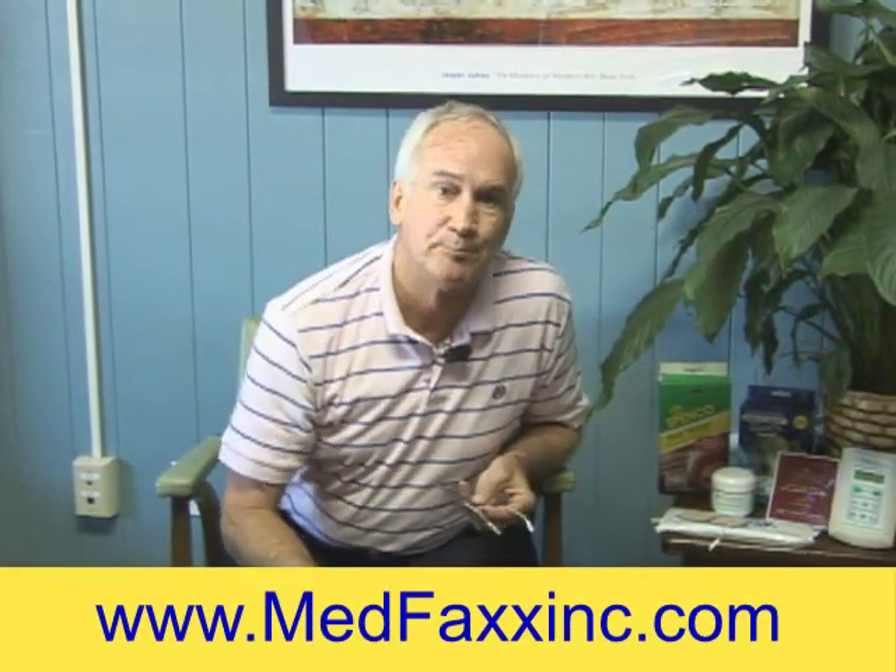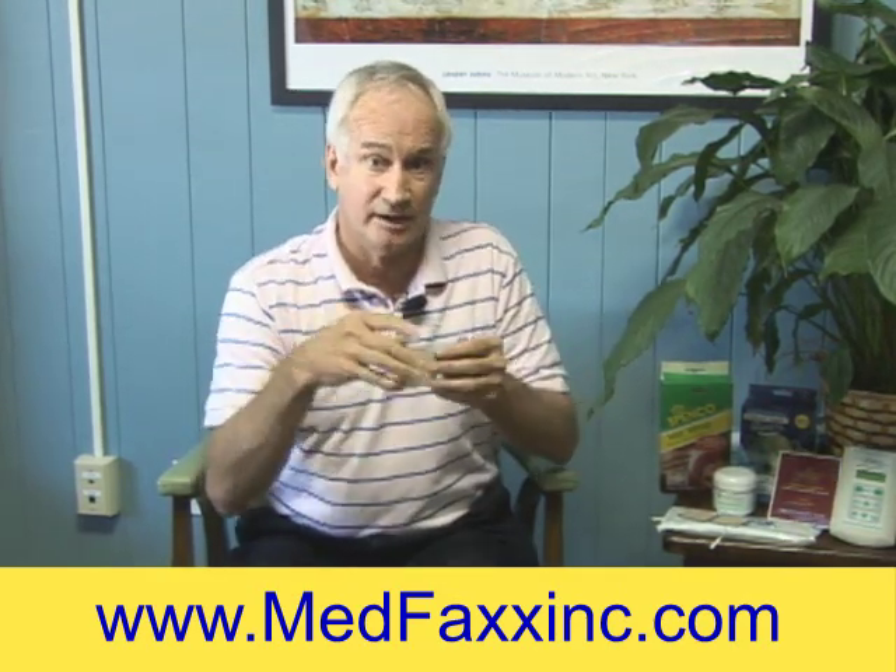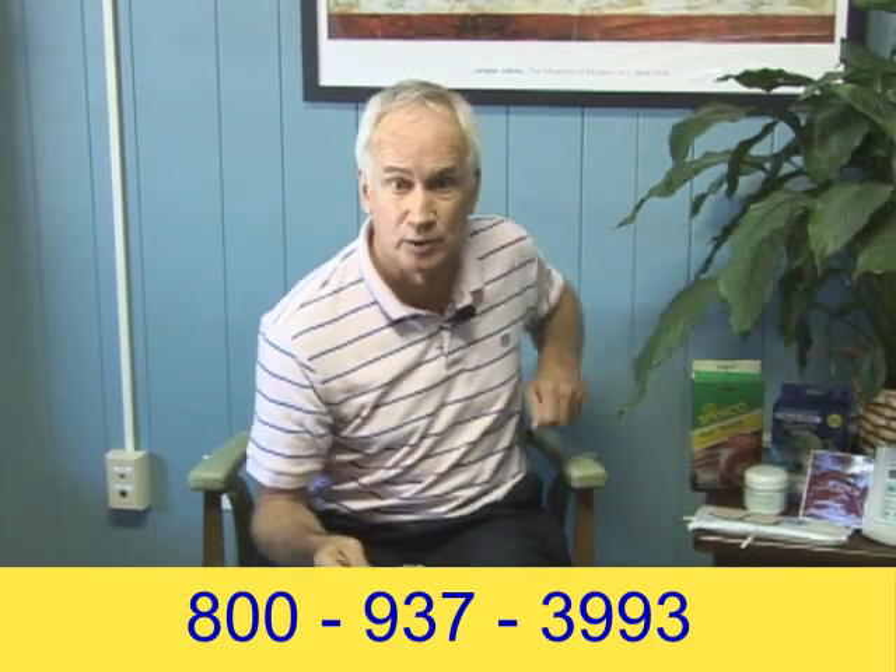What I'd like to show you is for your hip pain, and I know it can be on the right hip, left hip, or both. Now I've got my clothes on obviously, but I just want to show you the concept behind where to put electrodes for your hip pain. Because your hip area is larger than certain areas like an elbow, we may want to use larger surface electrodes — that's simply because the area we're treating is larger. A lot of times if we're using interferential we're going to use a three-inch round, and that's probably fine.